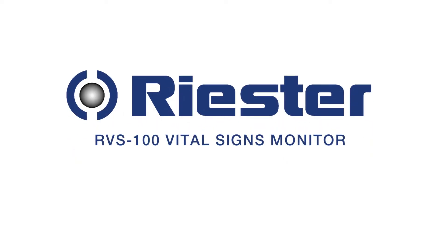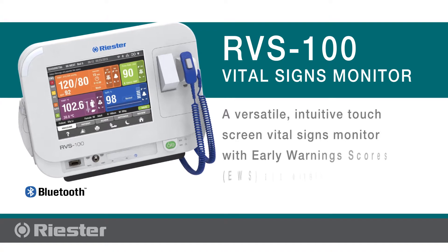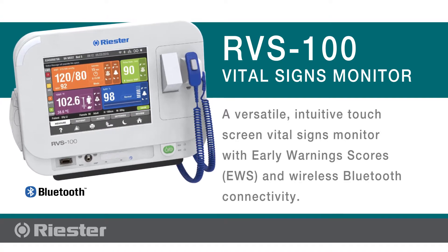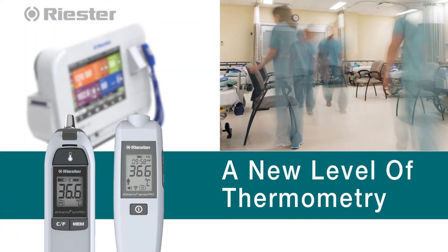The Riester RVS100 is a versatile, intuitive touchscreen vital signs monitor featuring early warning scores and wireless Bluetooth connectivity to the Riester Rethermo TimPro Plus and Sensio Pro Plus thermometers.